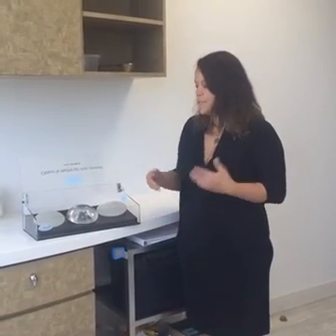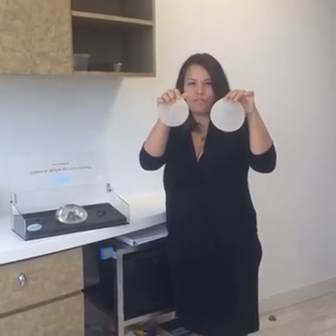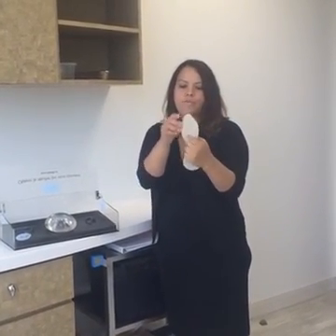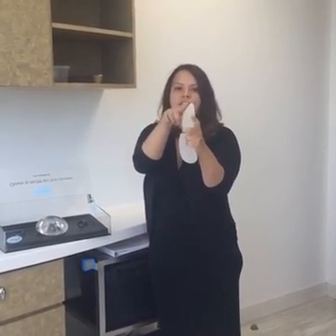Then you need to think about the shape of an implant. Implants come in two main shapes, anatomic and round. An anatomic implant looks a little bit like a teardrop. From the front, you'll see that all implants are roughly round or oval shaped, but from the side, you'll see that an anatomic implant is fuller at the bottom. It's made to resemble a more natural, smaller breast. Whereas a round implant is a little bit fuller, and it's designed to give you a little bit more fullness or a little bit more cleavage.